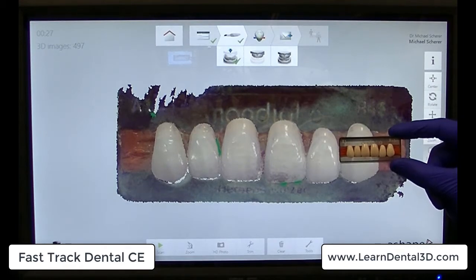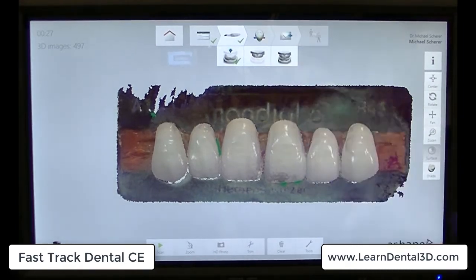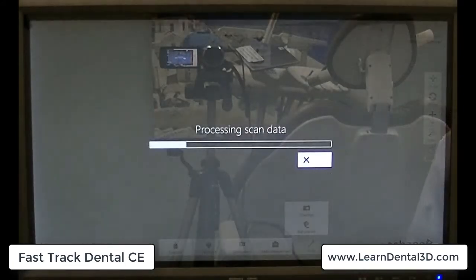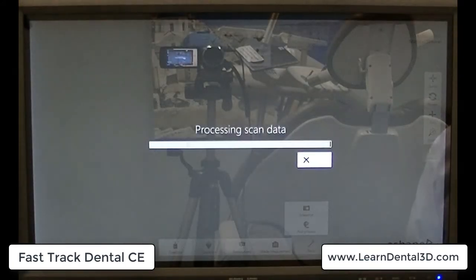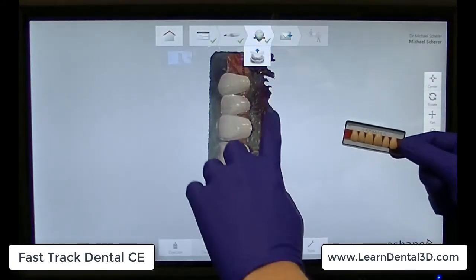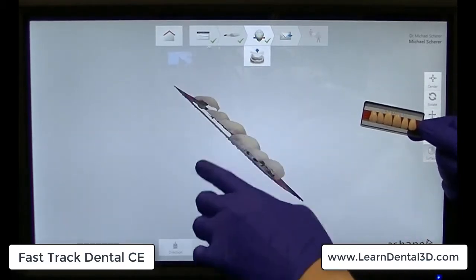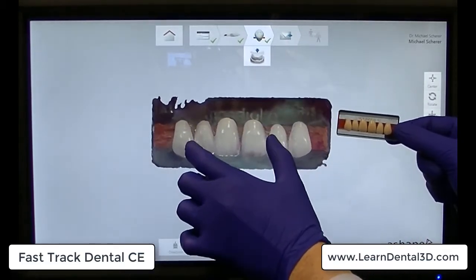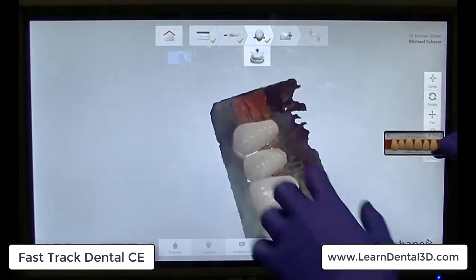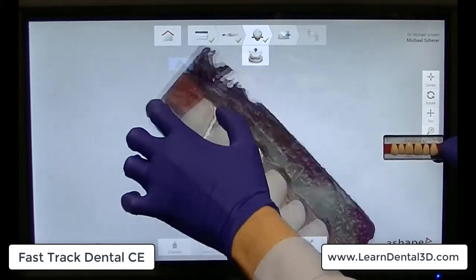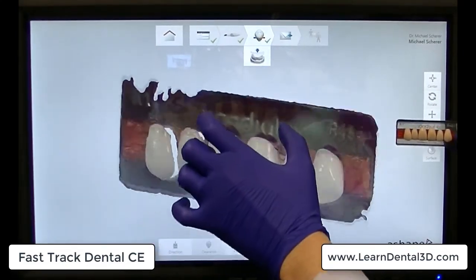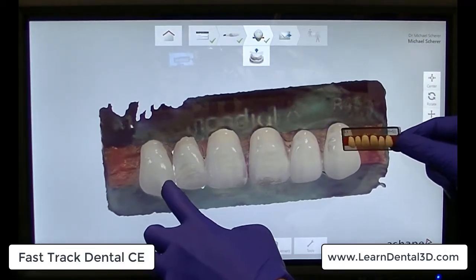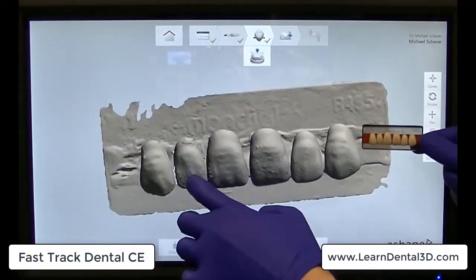Even though we're capturing this with our intraoral scanner, we can use this in our laboratory setting. By analyzing the scan in our post-processing tab, Trios will then automatically go ahead and start cleaning up our denture tooth card scan. This is really amazing because you can see the fidelity between the left and the right showing you the denture tooth card, and the magic here is what we're going to do with it next.